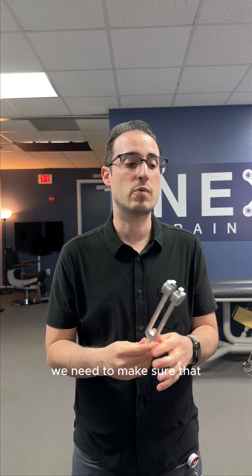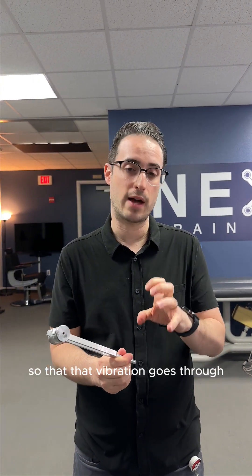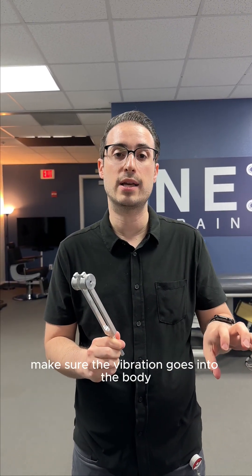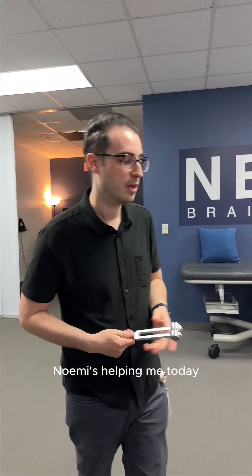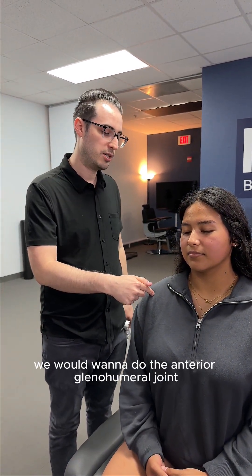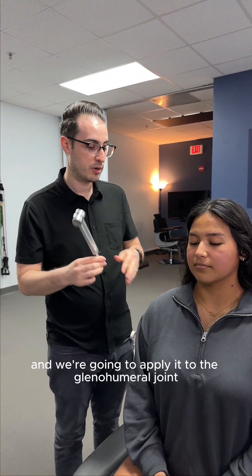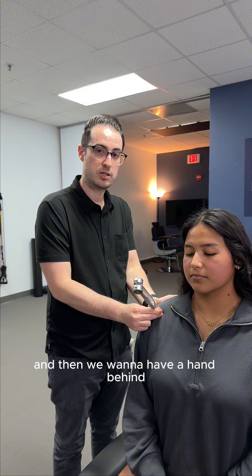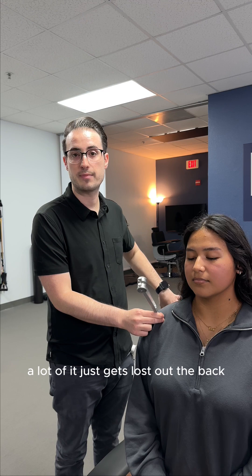As we apply the tuning fork to our patient's body, we need to sink it to bone whenever possible so the vibration transmits as best as possible. We also trap the vibration with our opposite hand. For example, if we're doing the C5 dermatome, we apply it to the anterior glenohumeral joint — we flick the tool, sink right to that bone, and place a hand behind to trap the vibration in. Without a hand behind, a lot of the vibration just gets lost out the back and it's not as good a test.